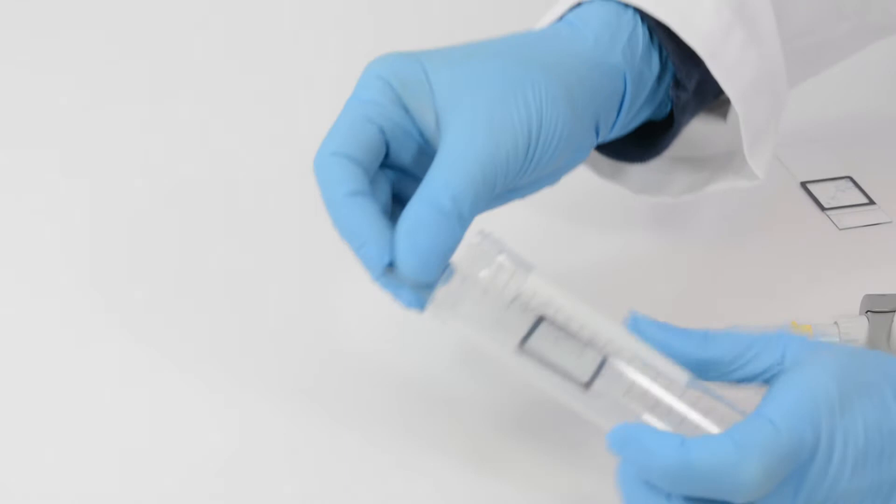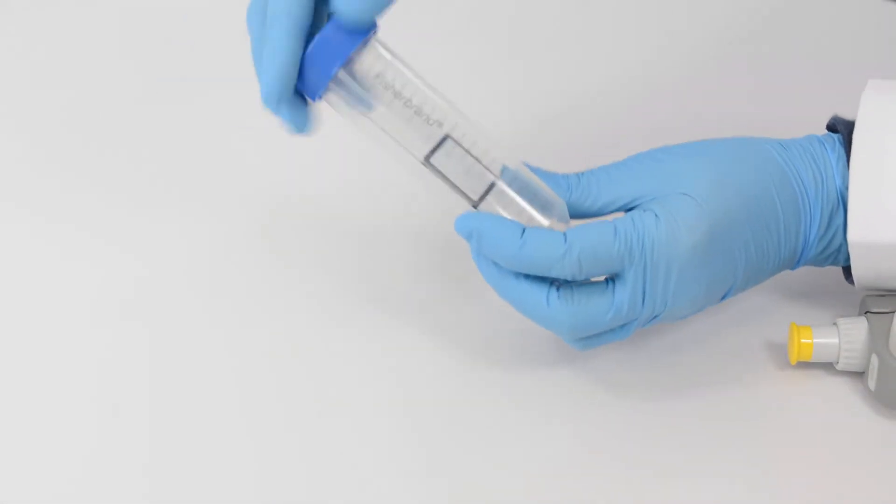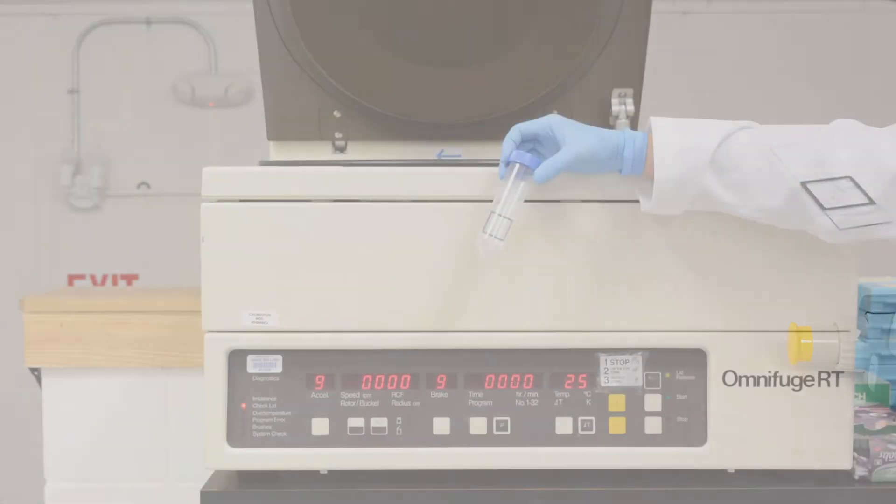Reagent removal can also be performed by inserting a slide into a 50 milliliter conical tube and centrifuging at 1000 RPM.